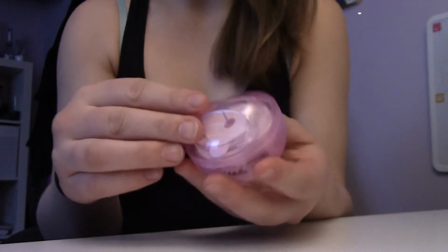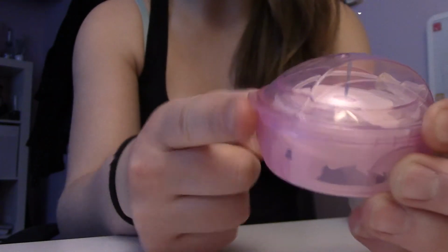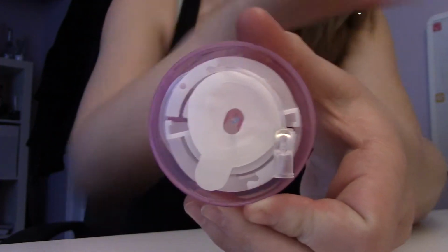Next thing I do is I take the top part off. There's a little tab on the side. I don't know if you guys can see it coming off there. Use that just to pull off the top. And now you've exposed the inside of your insertion site.